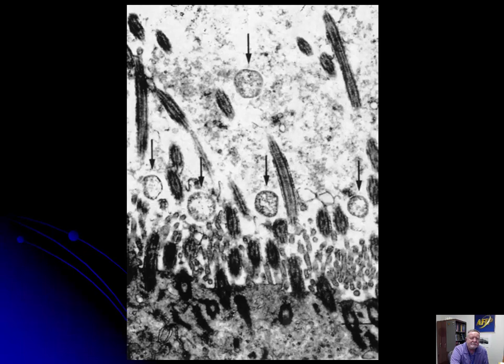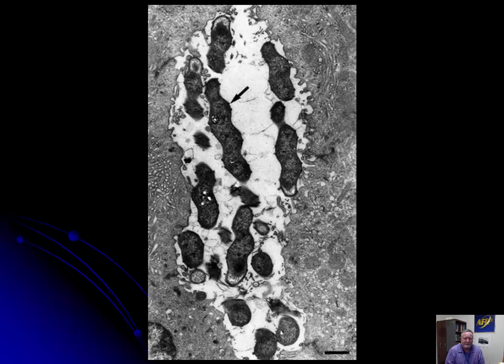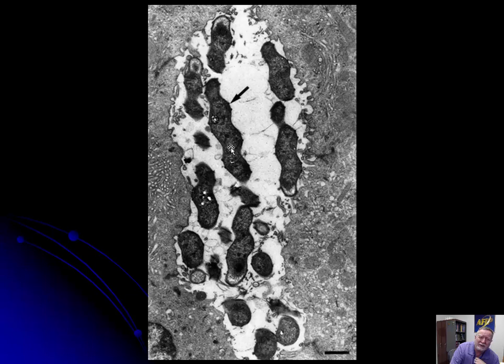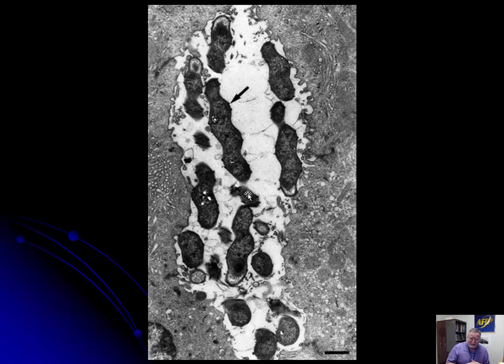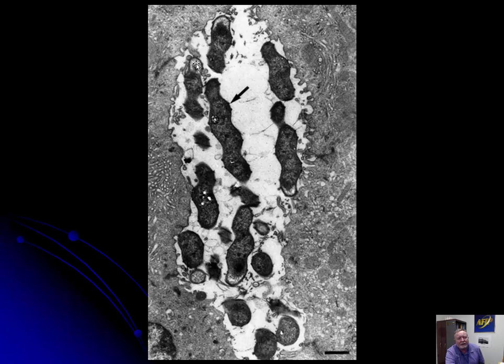Moving on from cilia-associated bacteria, we have the spiral bacteria. This is Helicobacter felis in the stomach of a dog. Almost every species has one or more Helicobacter species, commonly seen in the dog. They have a spiral appearance and can be very tricky to stain on silver stain or with osmium, which tends to make a line or cylinder instead of this nice wavy spiral bacterium. Note at one end of the bacterium is a flagellum. If we could get closer, we would see the very characteristic 9+2 arrangement of doublets and singlets, characteristic of cilia — the same arrangement from bacteria all the way to very sophisticated mammals like man.